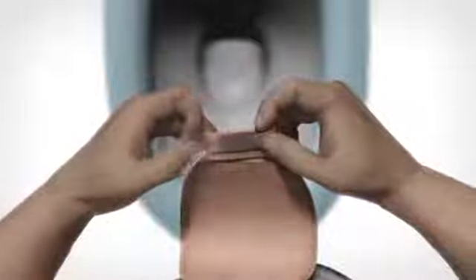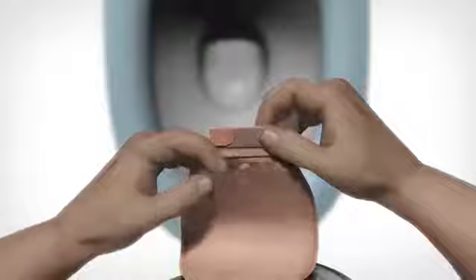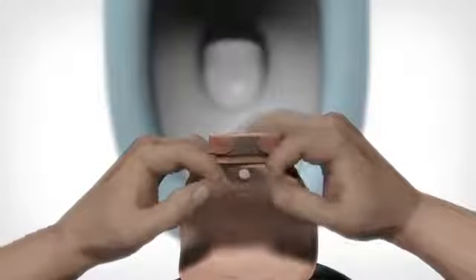Seal the outlet by folding the velcro ears onto the velcro pad and press firmly. The whole closing system can now be folded up in the hide-away pocket to appear more discreet.